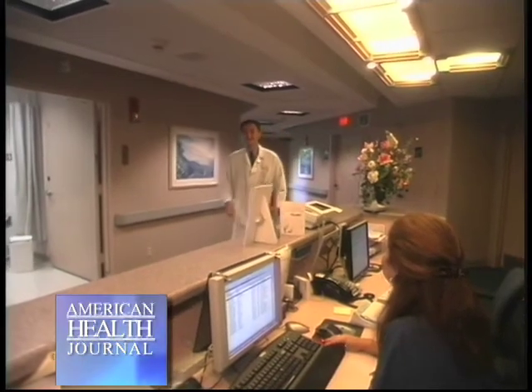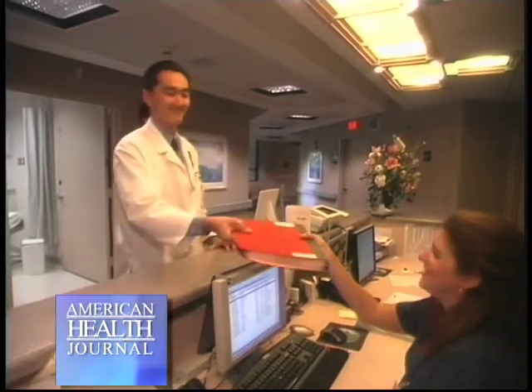In addition to that, because of the CAT scan, you can see tumor response on a day-to-day or week-to-week basis. And in a lot of situations that we've seen already, tumors do respond while you're undergoing radiation treatment, and we can make adjustments, redo plans as necessary based on these images that we're not able to get with conventional machines.